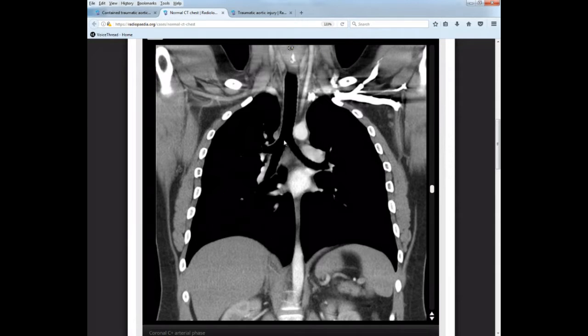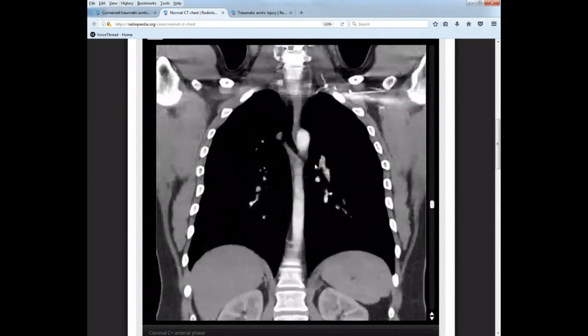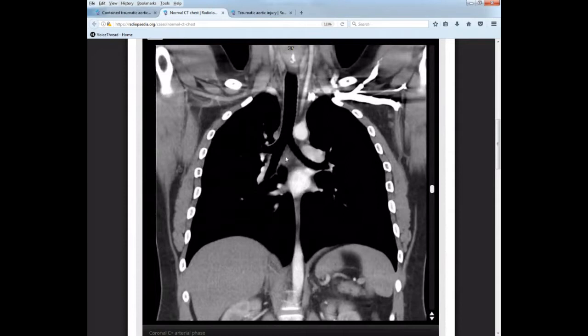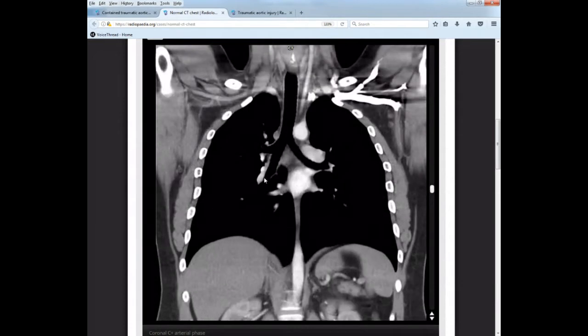So I want you to see that. Here's your right main stem. Your left main stem is a little bit longer before it eventually branches into its secondary and then branches again into lobar. The right branches pretty quickly and shoots off, but then this one branch of the secondary is still straight down. It's still pretty vertical. So still allowing for easy foreign body invasion. So there's your trachea going down.